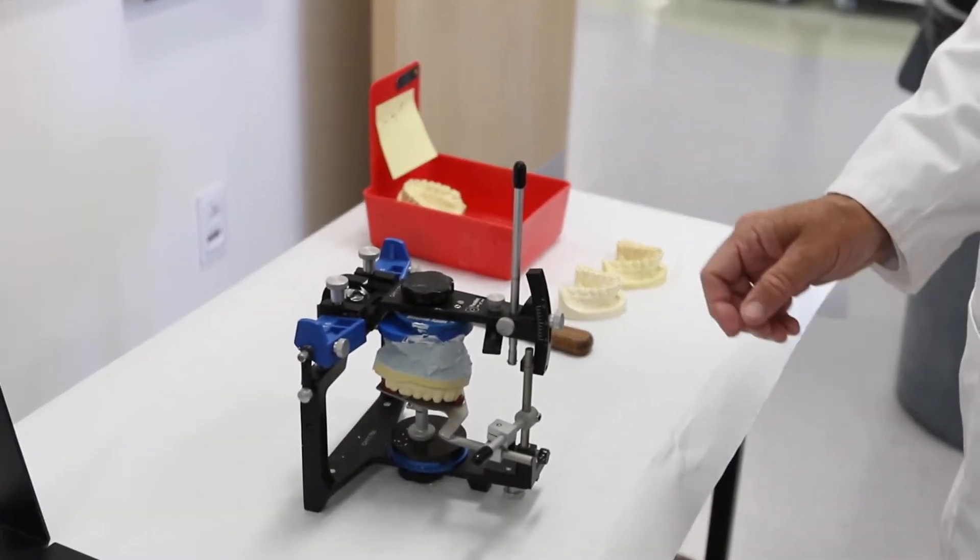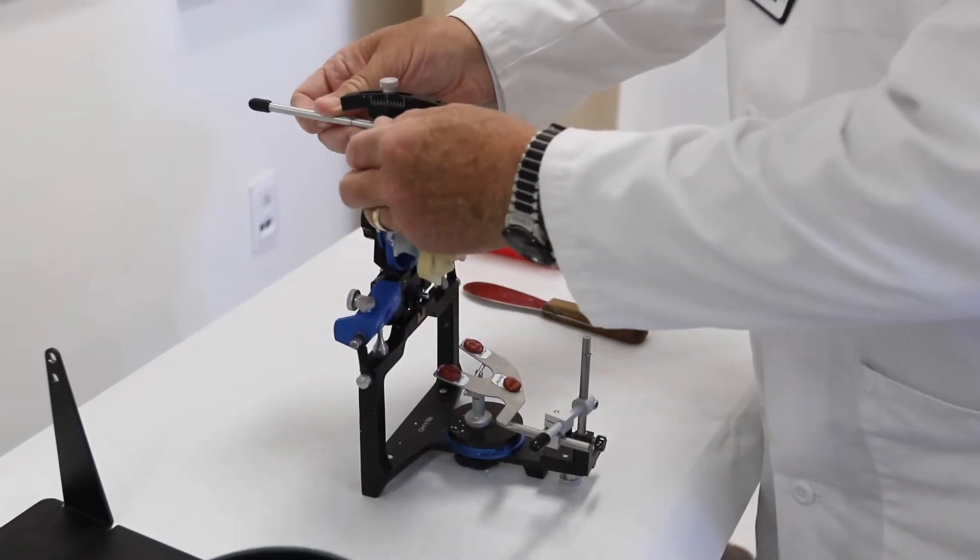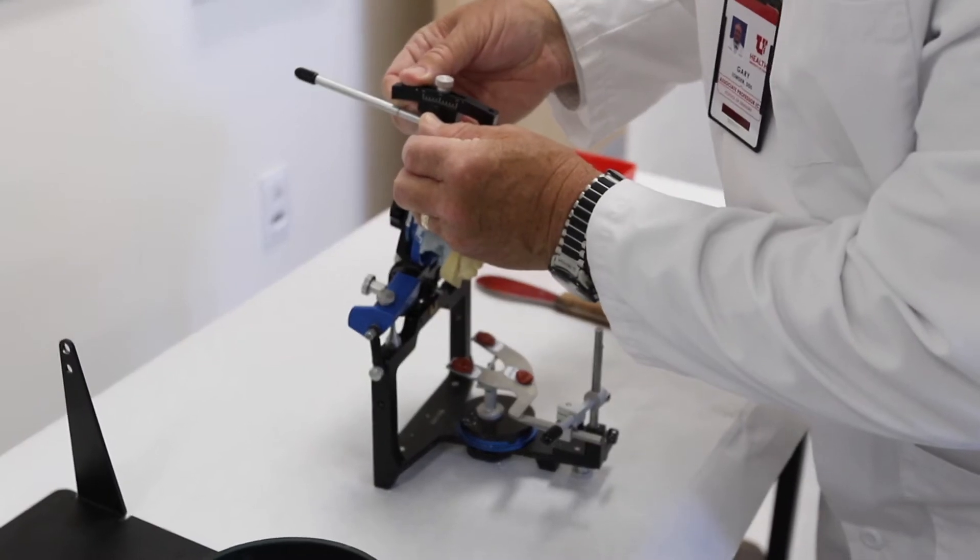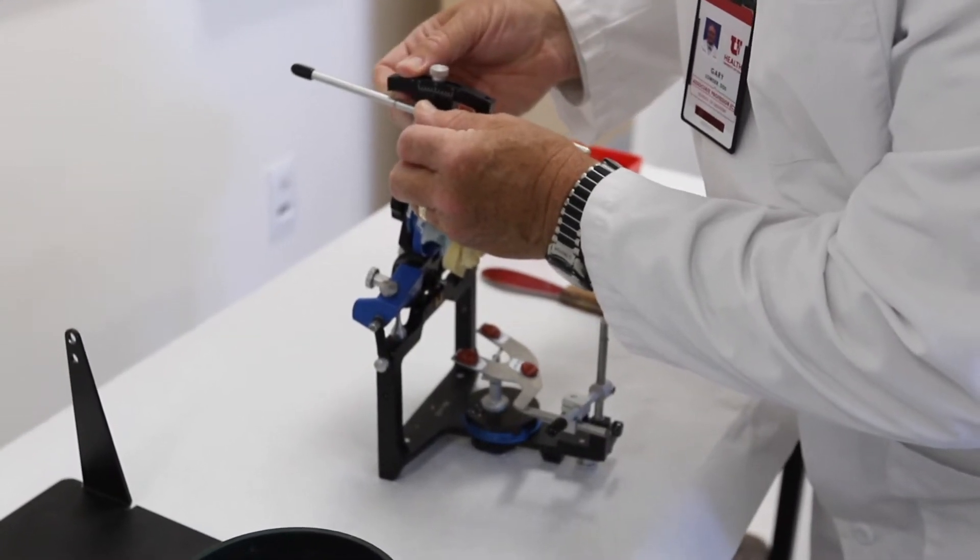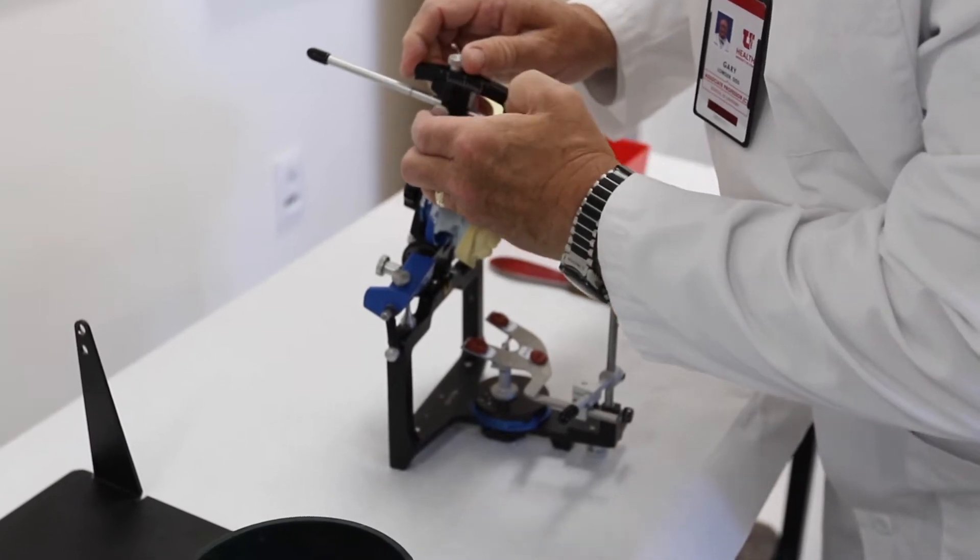So once your mounting stone is set you can now open your articulator. It's a good time then to change the setting on the incisal guide pin to a plus two, which will allow for the thickness of the wax record.